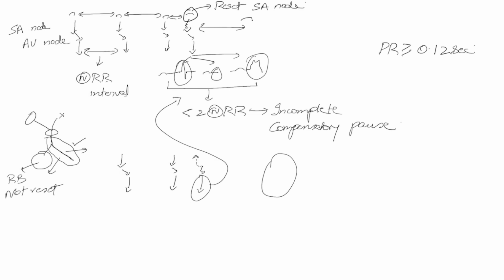So if it's coming from high above or close to the upper part of the AV node, you would notice that there is a P wave, usually inverted, immediately before the QRS. So it might look something like that. If it's coming from somewhere in the middle, you might just see a flat line with a QRS. So the P wave is embedded within the QRS. And if it's in the lower part, you might see that the QRS actually shows up, and then you might see a P wave hidden after the QRS complex.